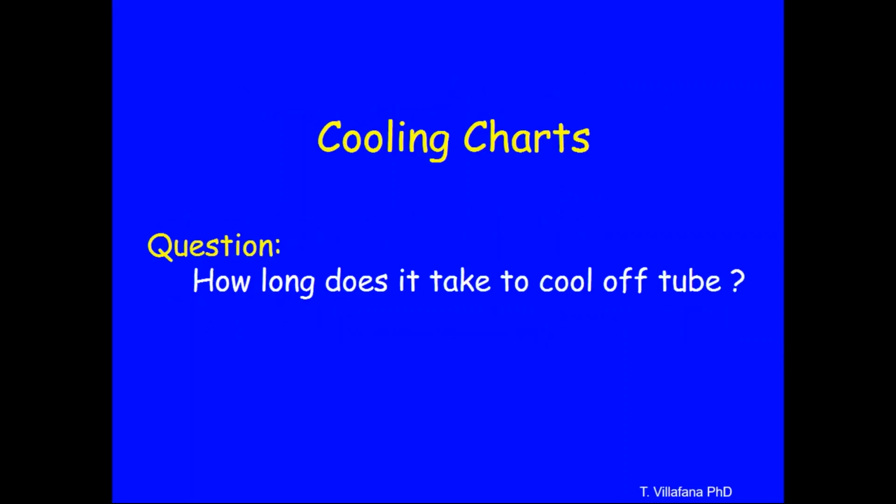Okay, there's one more chart, and we're getting very close to the end. Let's talk about the so-called cooling charts. What this is all about, remember, is that we don't want to blow up the tube. What we've just been looking at is what kind of exposures we limit ourselves to so that we don't blow up the tube.